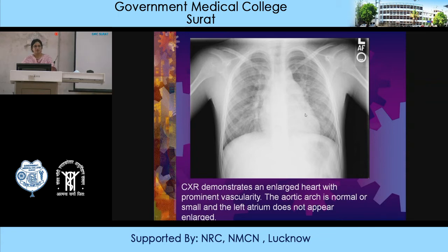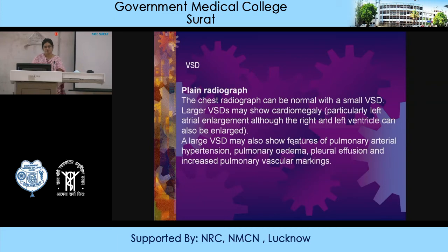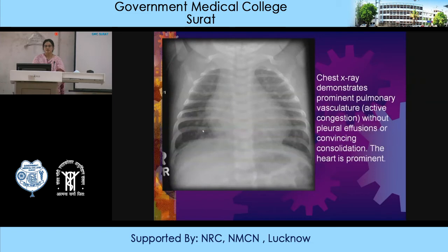VSD: chest radiograph can be normal with a small VSD. Larger VSDs may show cardiomegaly, particularly left atrial enlargement, although the right and left ventricle can also be enlarged. A large VSD may also show features of pulmonary arterial hypertension, pulmonary edema, pleural effusion, and increased pulmonary vascular markings. This case demonstrates prominent pulmonary vascularity bilaterally (active congestion), with no pleural effusion or consolidation and a prominent heart.